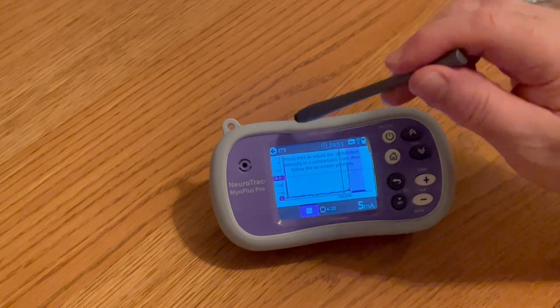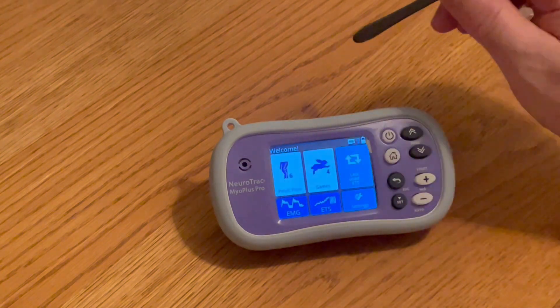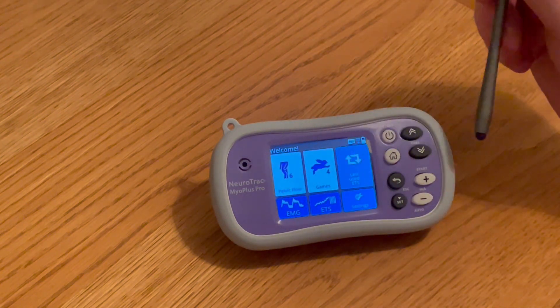At any stage, all you have to do is hit the ETS back button and you will stop the session.